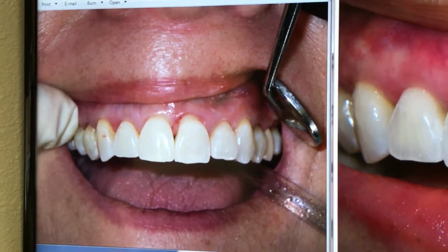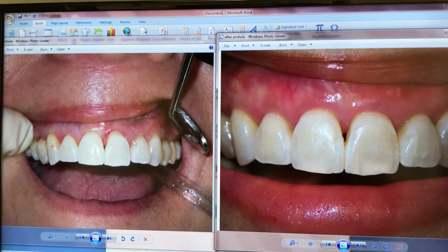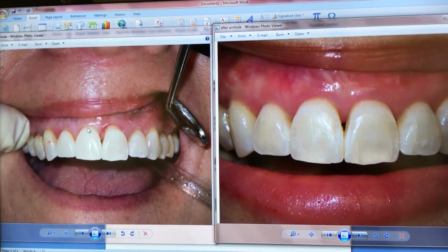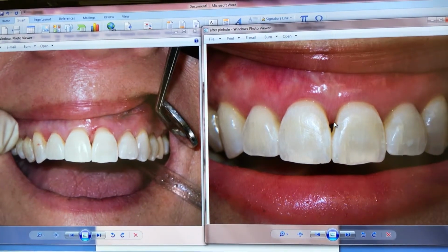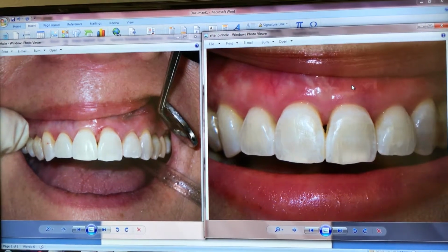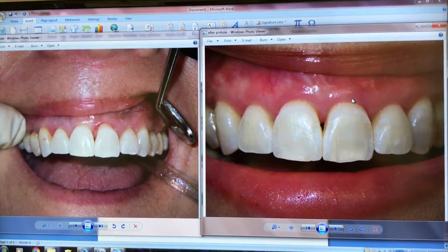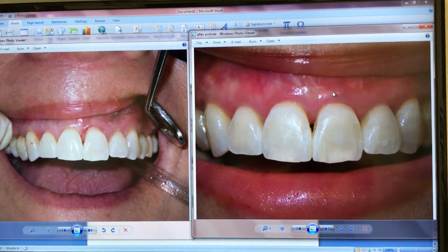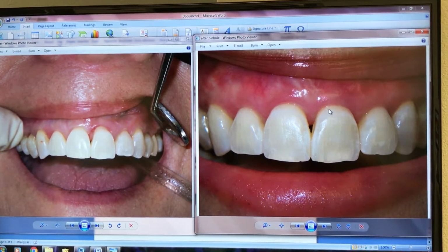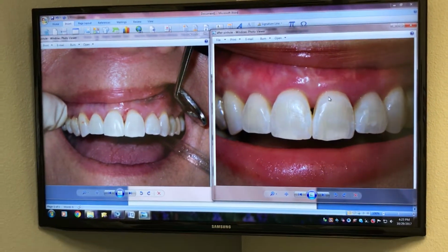And then the tissue is moved further down. You see the end result here. And the bone, because we put membranes here, the bone kind of moves down with it to give it more support. And the result is really good. One of the best things about it is that the color of the tissue is the same. We are not taking it from the roof of the mouth and grafting it here. Therefore, we don't have a different color here or here like when we do it with the other methods. Sometimes we get that result and it's not good.